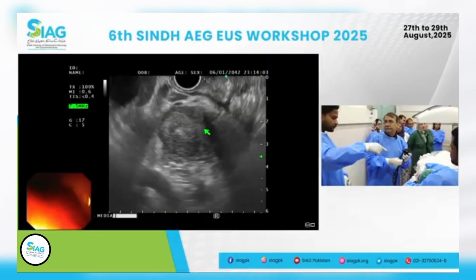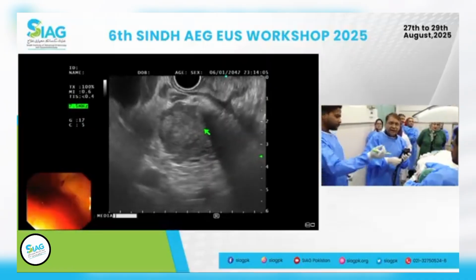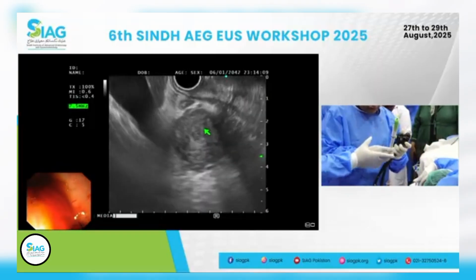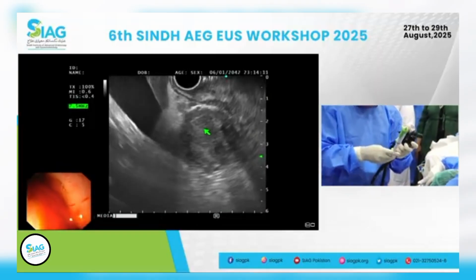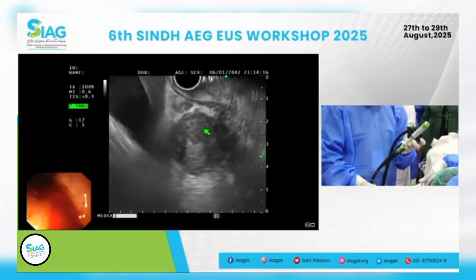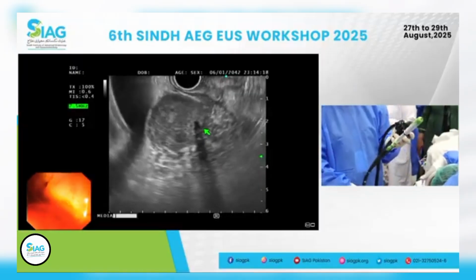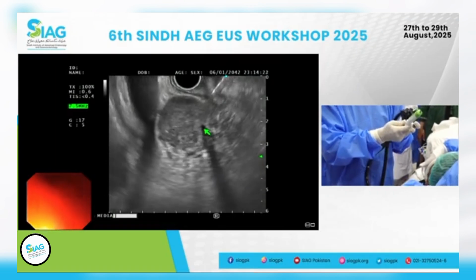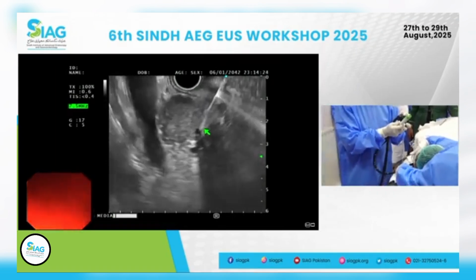Okay. So if you don't get enough without suction for the solid masses, you can always use suction, but that sometimes causes more blood in the specimen. So I try to avoid suction, but sometimes I can use what I call an intermittent suction.